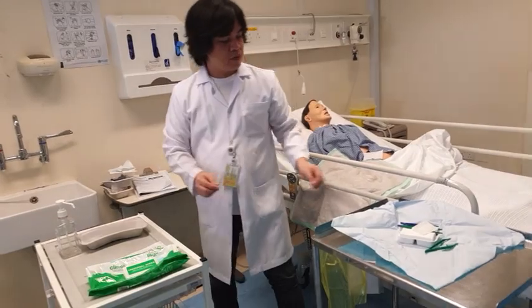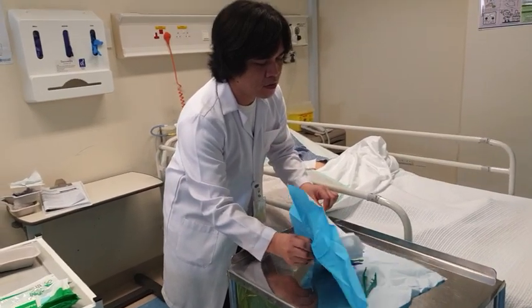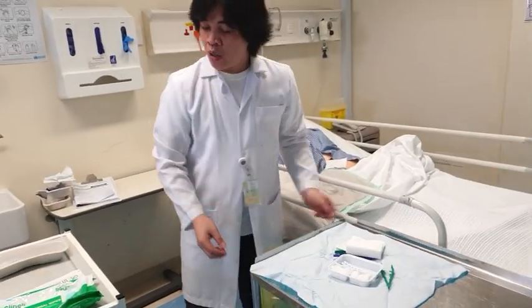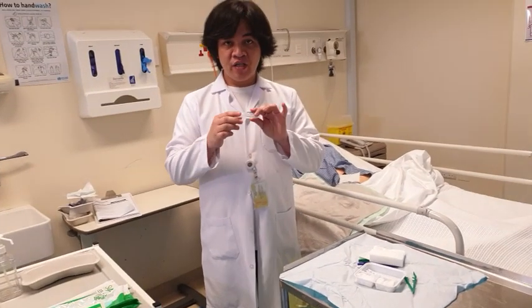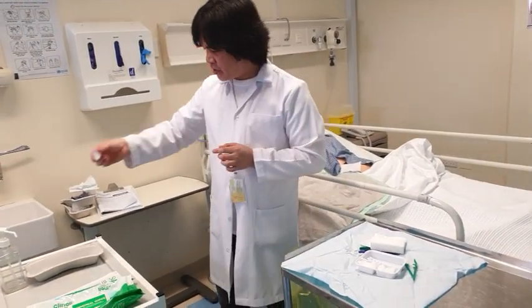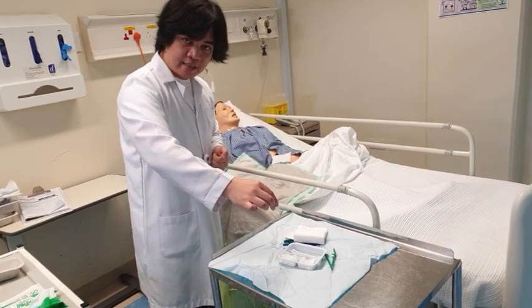Okay. What else is missing? At this point, we're going to put the cleaning agent to our table. We have the normal saline here. Open the normal saline. Discard the first drop and pour it into our set.